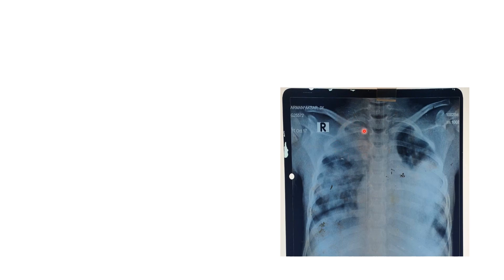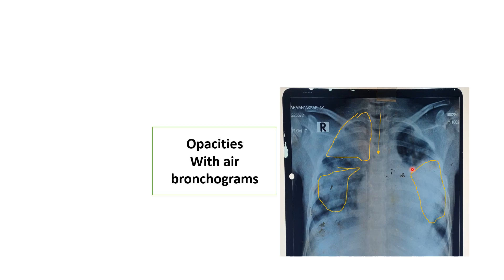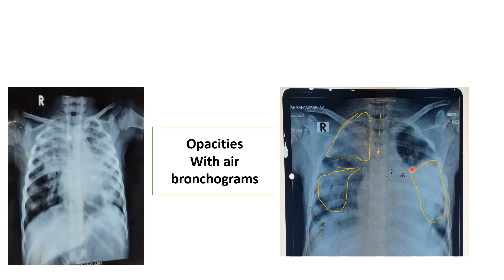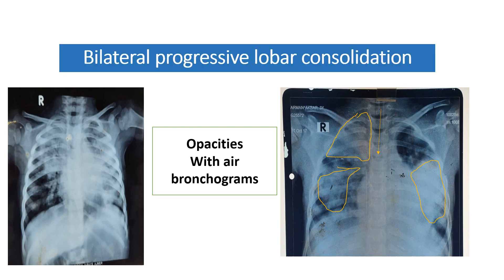In this x-ray, opacity is present in the right upper and middle zone, and also in the right lower zone with air bronchogram. Even in the left lung field, left lower zone, opacity is present. Multiple opacities with air bronchogram are present in both lung fields. Similarly, in this next x-ray, the trachea is in the central position with opacity in the right upper and middle part and throughout the left lung field. The diagnosis for these two x-rays is bilateral progressive lobar consolidation.